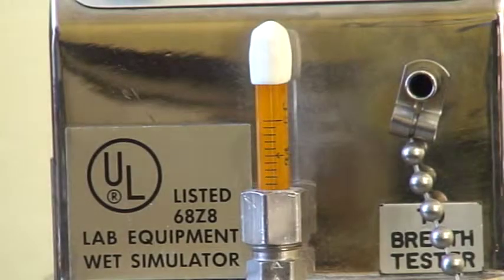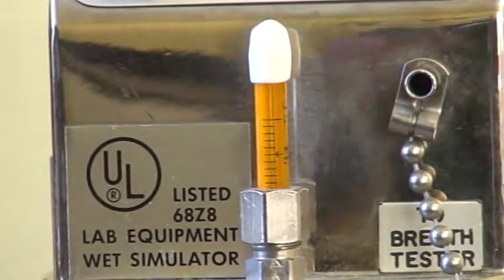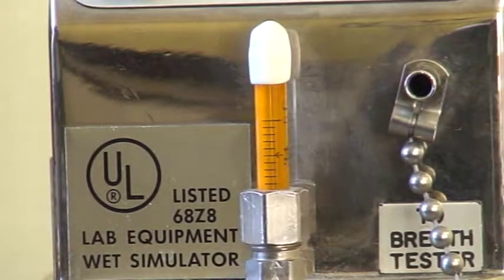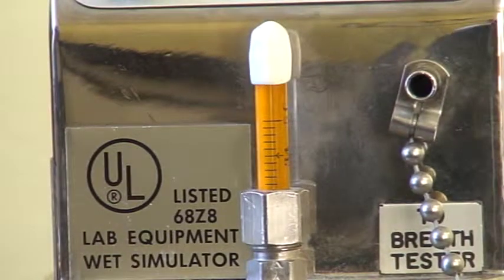I can read it now, and it's dropped down to 33.9 degrees Celsius, probably because I've been playing with it. You can see how sensitive it is. We'll see if we can see the mercury column — no, it's not visible to me in the camera. I will zoom up as close as I possibly can.